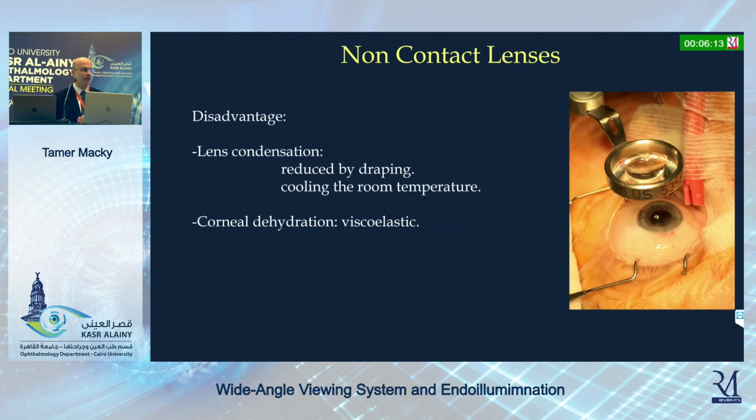The disadvantage of the non-contact system is that they produce lens condensation, which could be reduced by draping or cooling the room temperature, and we can also have corneal dehydration during the surgery, which could be compensated by the viscoelastics.